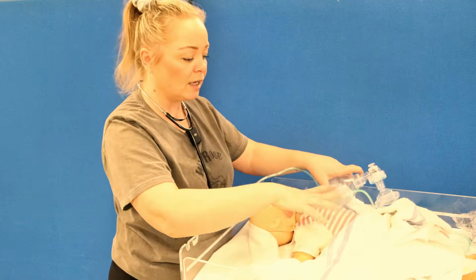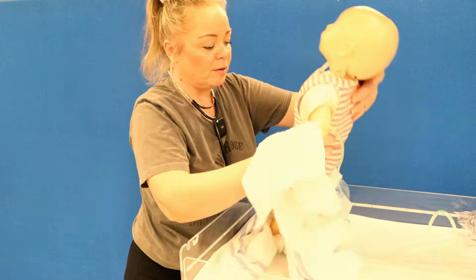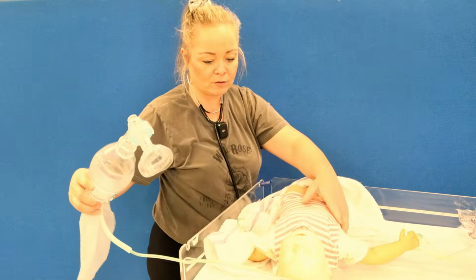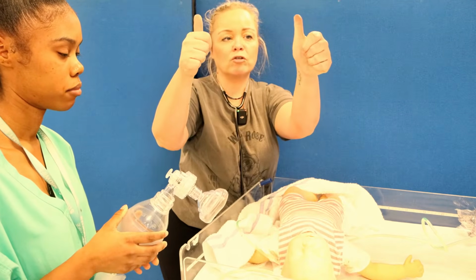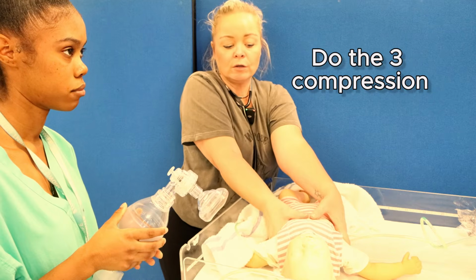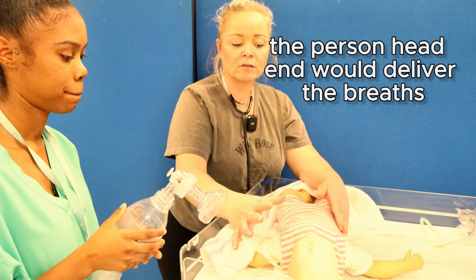Another option in doing the compressions, once more help arrives, my lovely assistant can be on the bag valve mask. If you stand there for me, I can use my thumbs. Your thumbs are generally a lot stronger. They've got nice muscular structures here. So in the same place, just below the nipple line, you would use your thumbs to do the 3 compressions, and then the person at the head end would deliver the breaths.